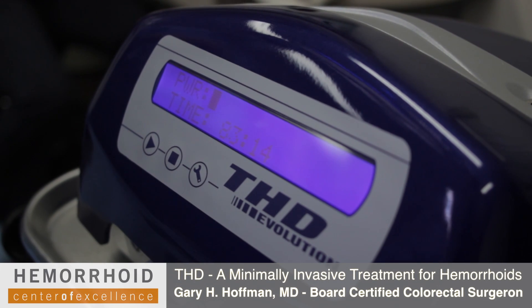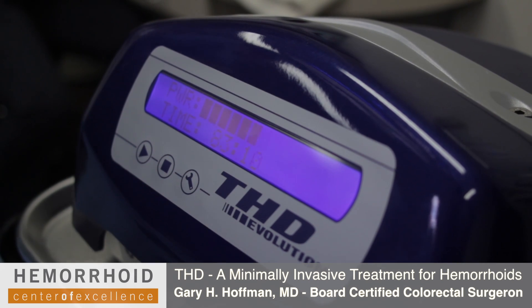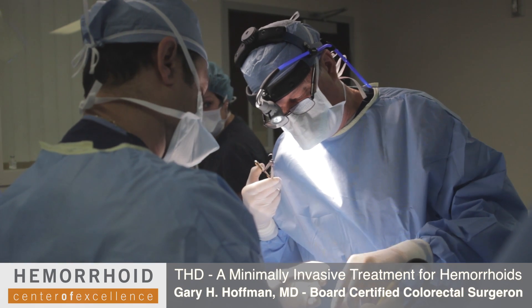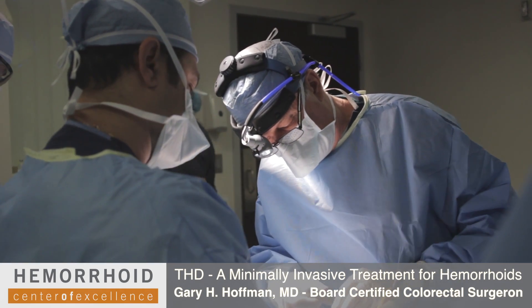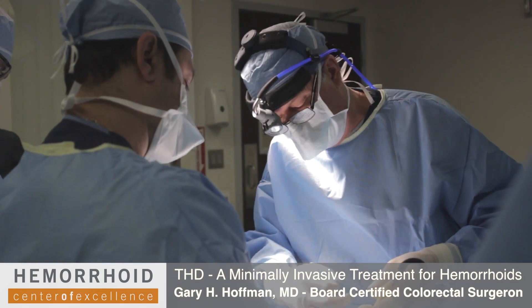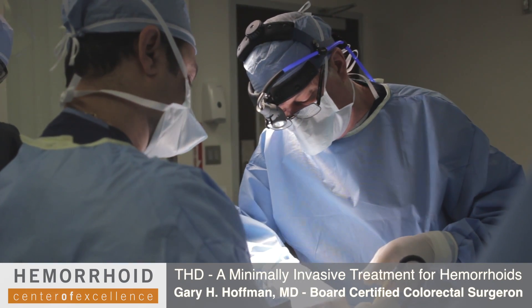What you hear is the sound of the arterial inflow, or the blood flow, going into the hemorrhoid. With THD, we try to find that hemorrhoid and tie it off after we've lifted it up. I've placed the first stitch now, and you can no longer hear the artery pulsating because it's been effectively ligated or tied off, and the blood flow has been occluded.